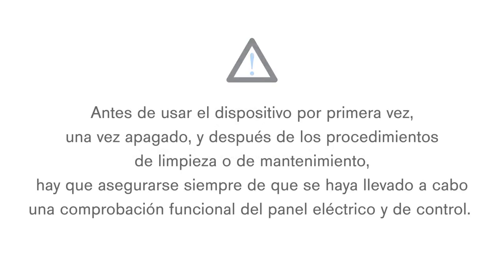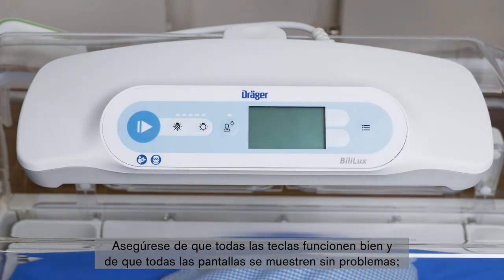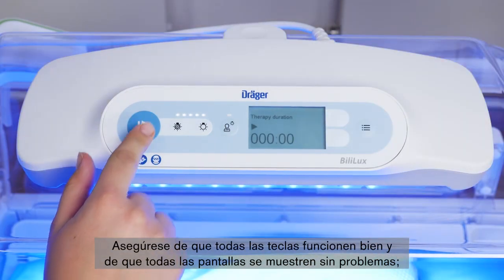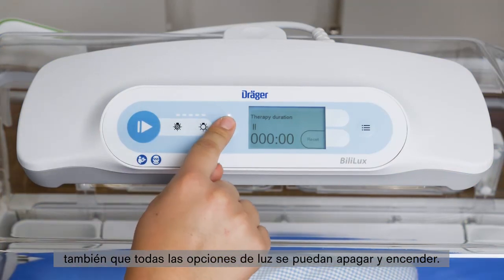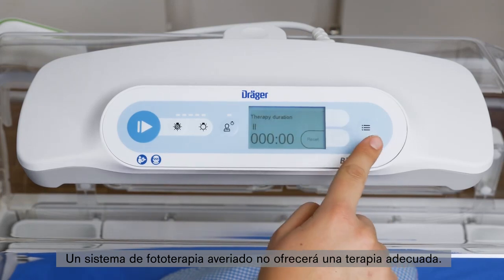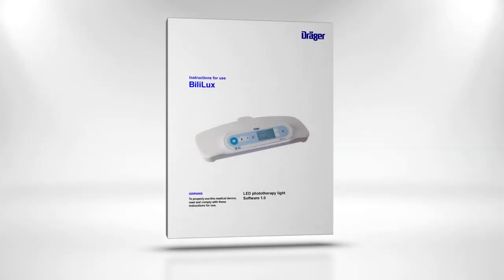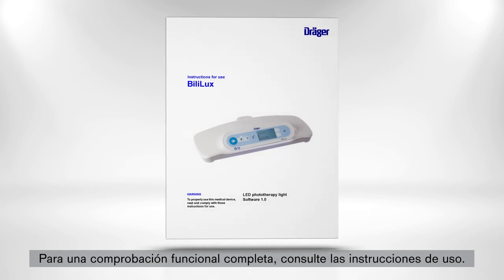Before the device is first placed into service, after it has been turned off, and after cleaning or service procedures, you always have to make sure that an electrical and control panel functional check has taken place. Confirm that all keys function properly and that all screens are displayed correctly, and make sure that all light options can be turned on and off. A malfunctioning phototherapy system may not provide correct therapy. Do not use the device if a malfunction was detected during the functional check, or if any controls are not functional. For a detailed functional check, please refer to the IFU.